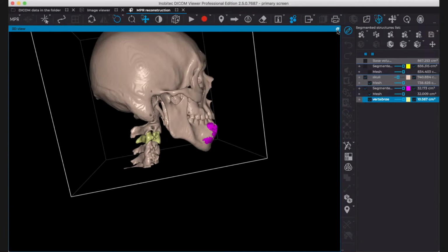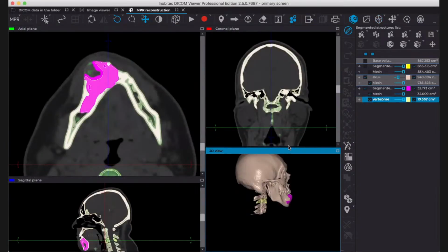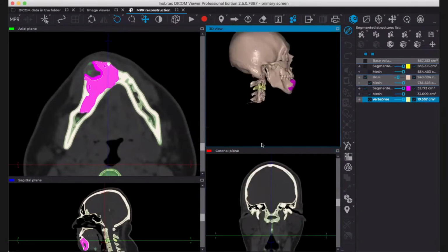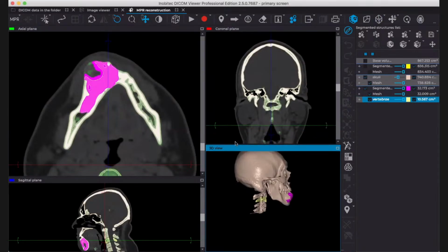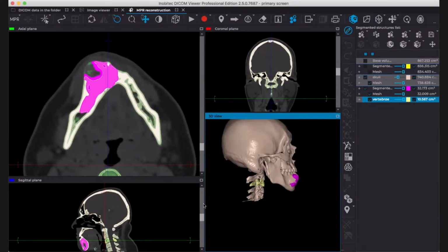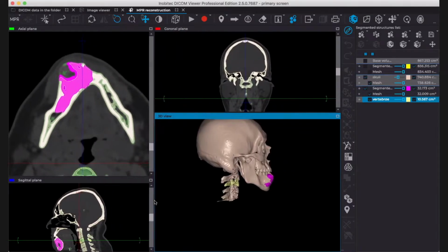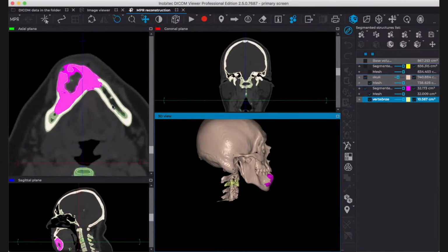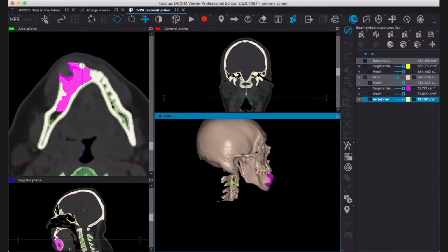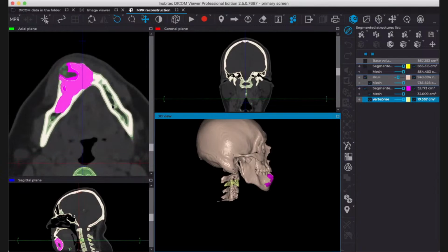I hope there will be some questions in the chat because I haven't seen any during your demonstration. I guess it was so captivating and fascinating that everybody was concentrated. Yeah, and they were just afraid to miss a thing because so many functions were covered by you, and they work pretty quickly, don't they? Exactly. They are very, very easy to use.